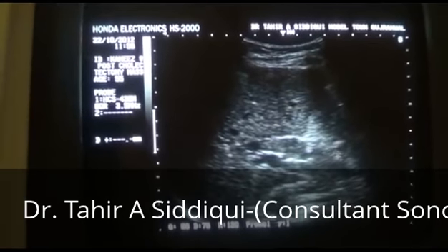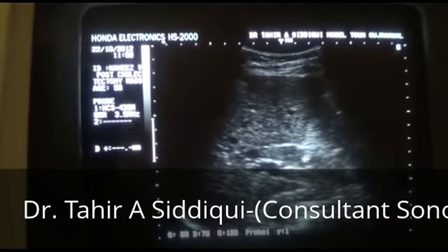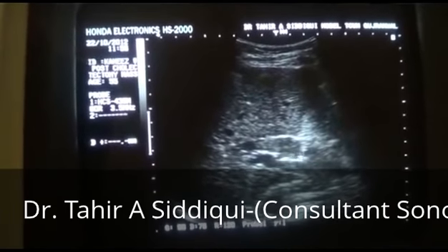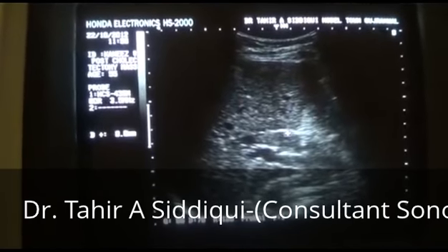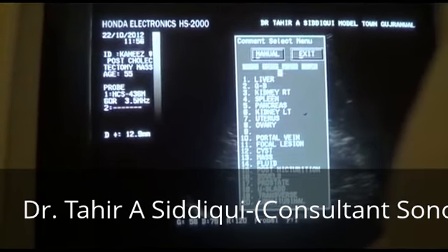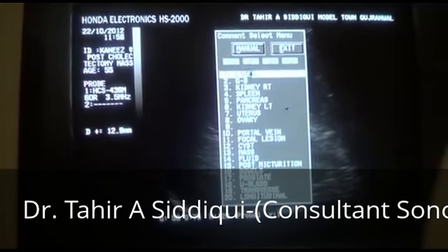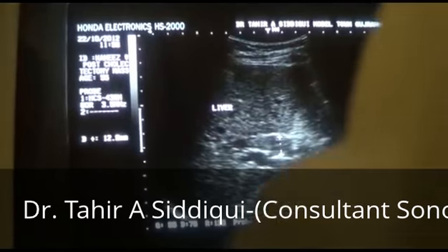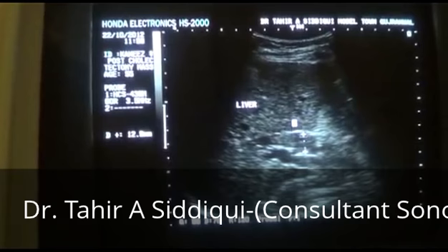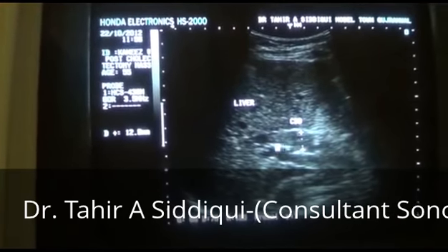This is the common bile duct, and it is filled with echogenic material of different strength and with tiny echogenic areas as well. The common bile duct measures 12.9 millimeters. Normal, it should not exceed 9 millimeters with removed gallbladder. So this common bile duct is dilated and is filled with sludge. This is sludge within the common bile duct.